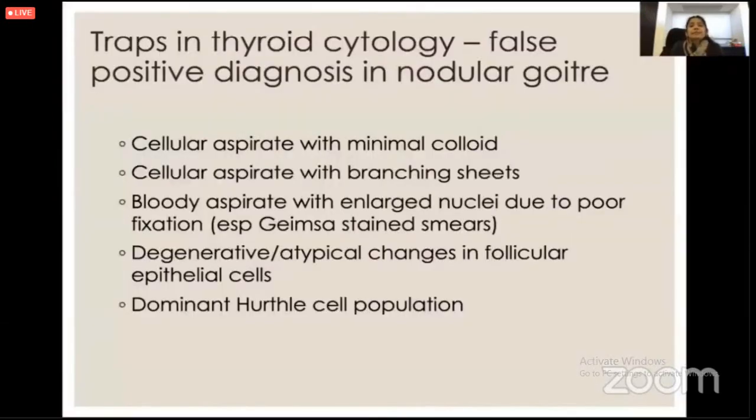So the traps, like false positive, are that sort of minimal colloid. That's why reporting in close contact with our clinician is very, very important. If it's a new person doing thyroid cytology for the first time, and I'm sure that in your practice it might be done by you guys rather than the radiologist, that's far better because you have the patient in front of you.